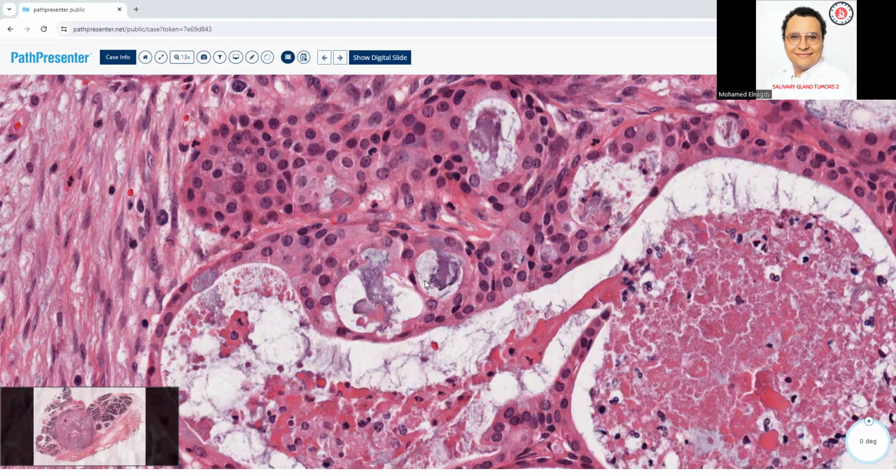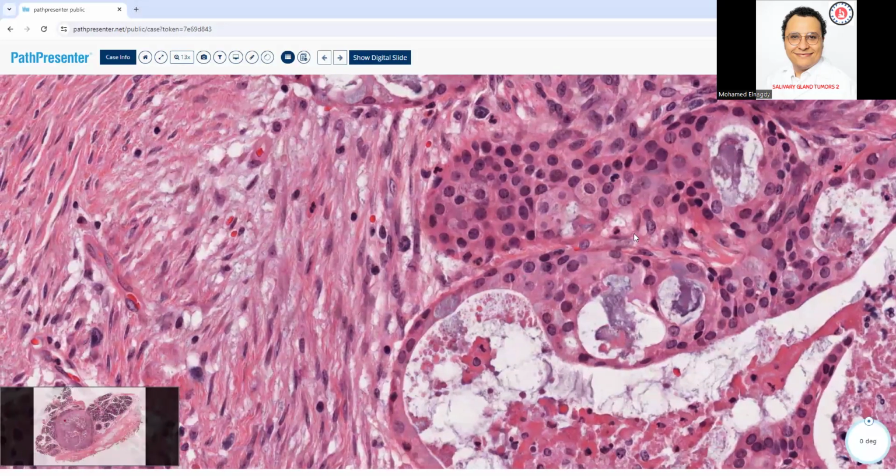Look at different areas, look carefully, and for at least 1 minute, start looking around and collecting the keywords while you are looking. And then at the end, reach the highly likely diagnosis, because there is always a lot of overlapping features. Like right here, you saw spindle cells. However, spindle cells might be reactive fibrosis or just some reactive connective tissue surrounding the mass, you know?